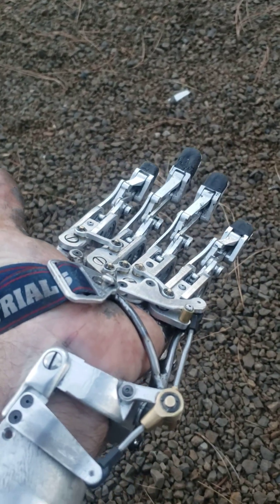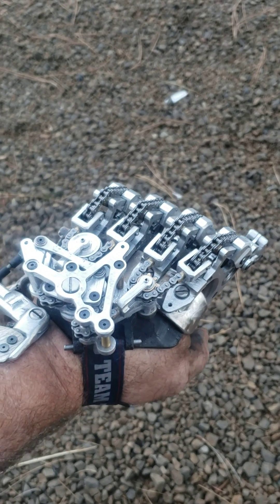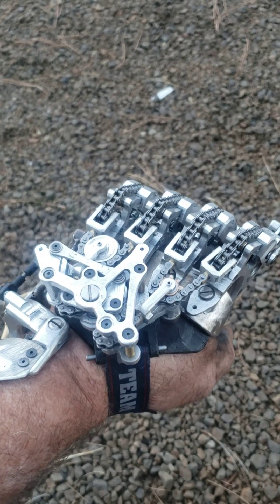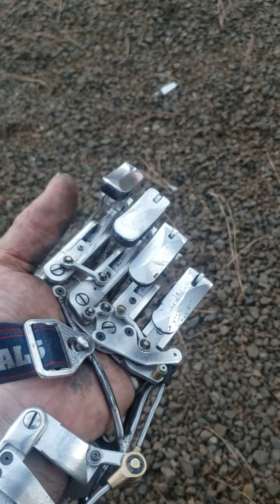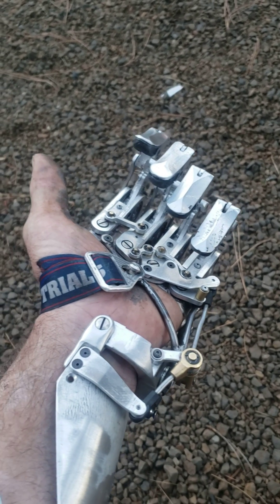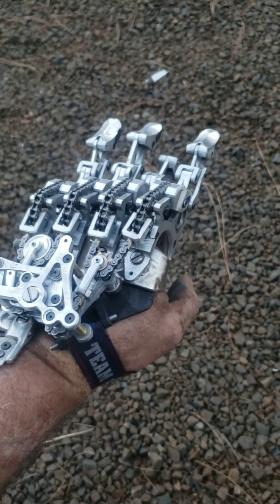We're doing something kind of like what I did on the last hand, with the adaptable grip positions — precision, tripod, index, pinky closed. I've been running with this for a couple of days now, two days to be exact.